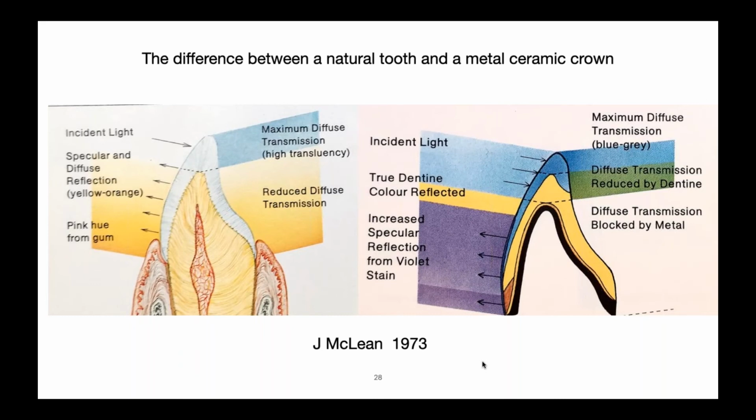I remember when I first started this in 1976 up in Gainesville area, this one doctor would take a plastic provisional out, and I would put in a PFM crown, porcelain fused to Degussa metal, the gold, the good stuff. And he would seat it, and all of a sudden the margin would look gray, and he would take that explorer and start jamming in there. And I said, the margin's fine. I said, the gold is blocking the light. And then he takes the crown out and puts this provisional in there, and the tissue and everything lights up beautifully.